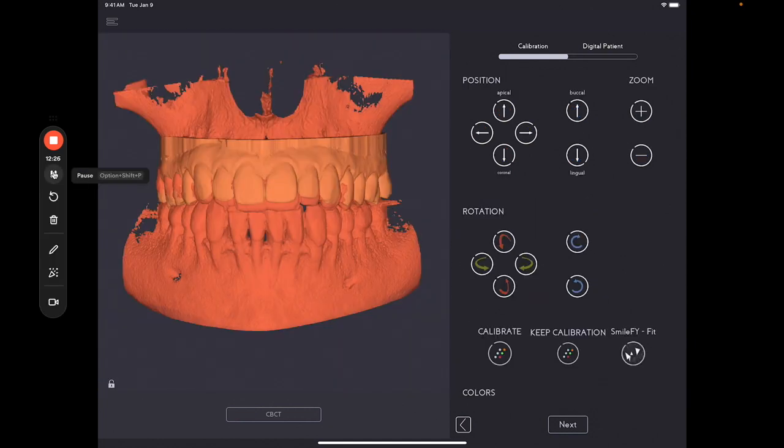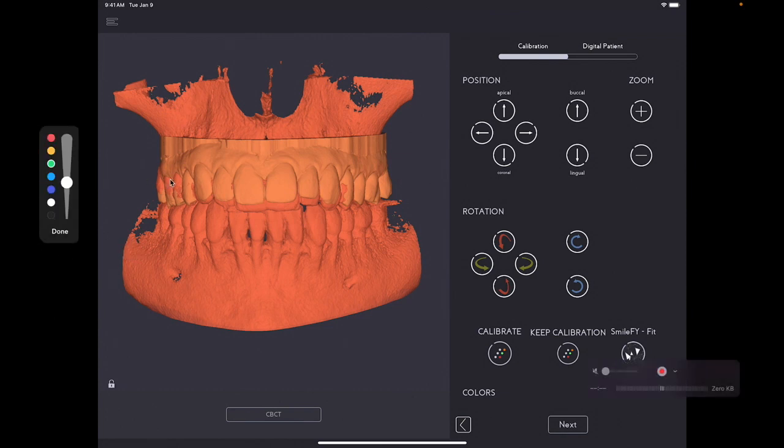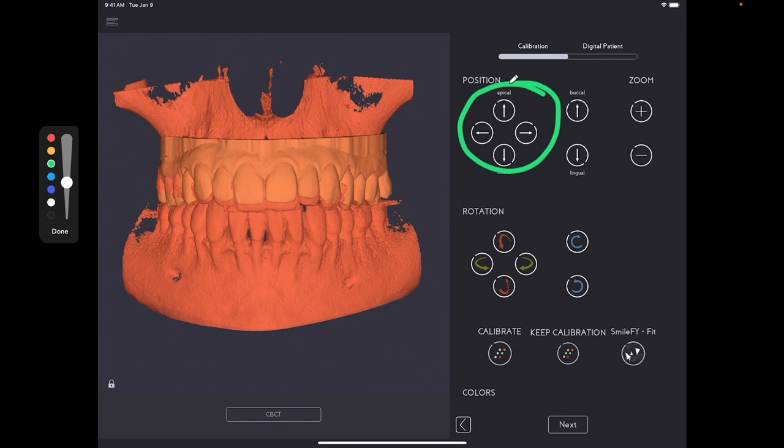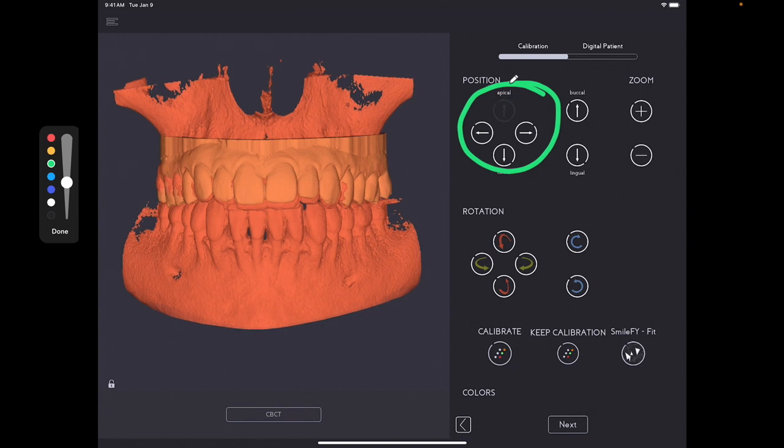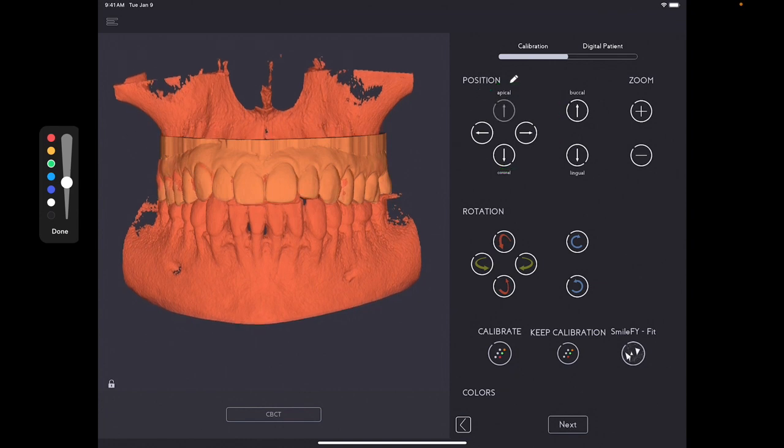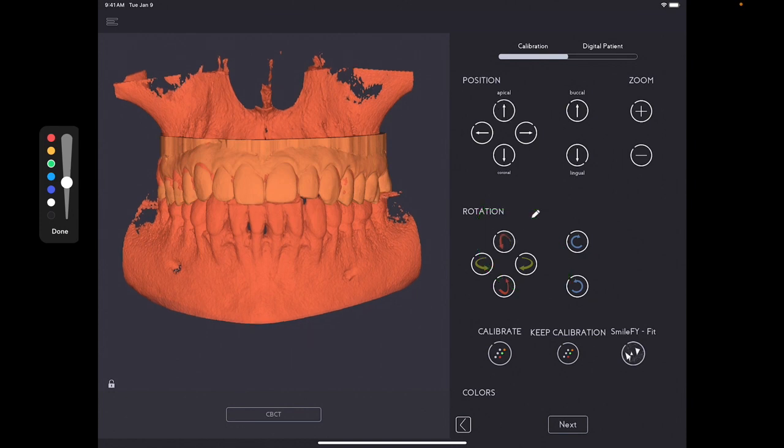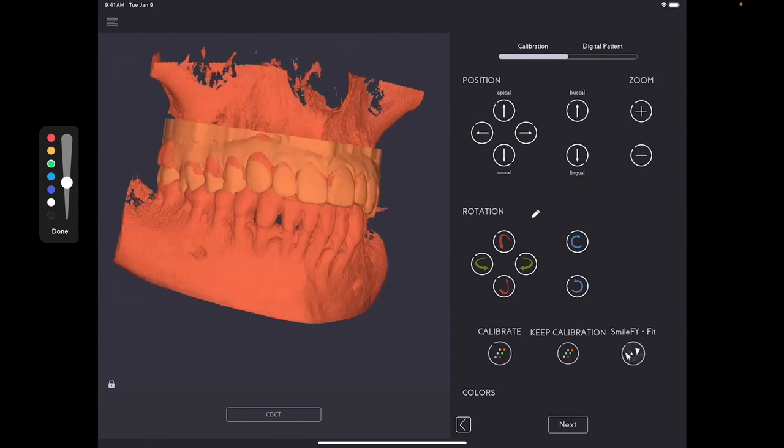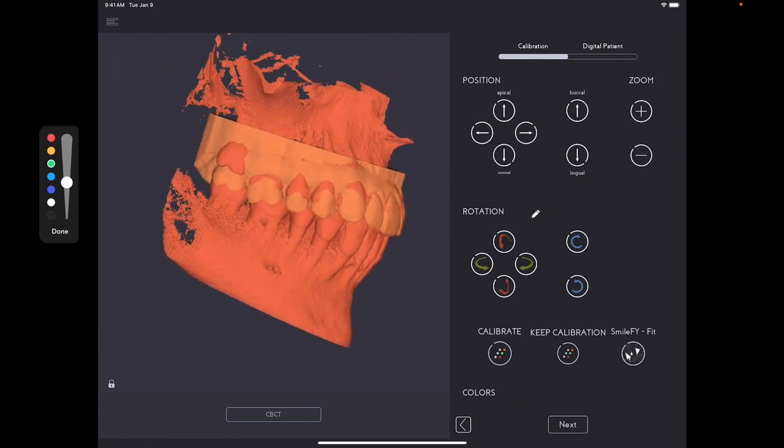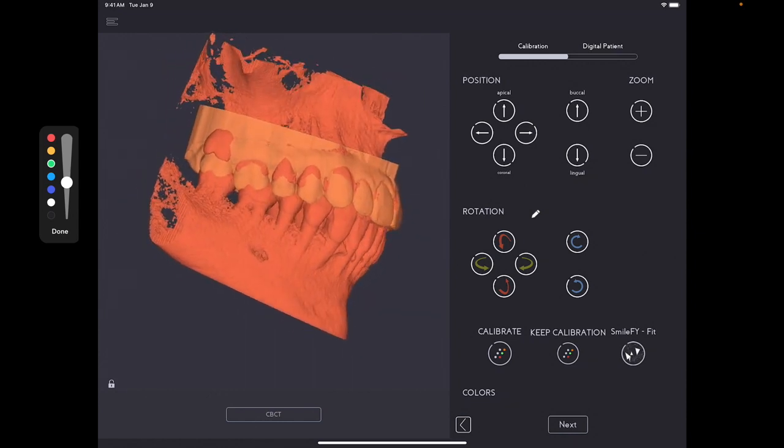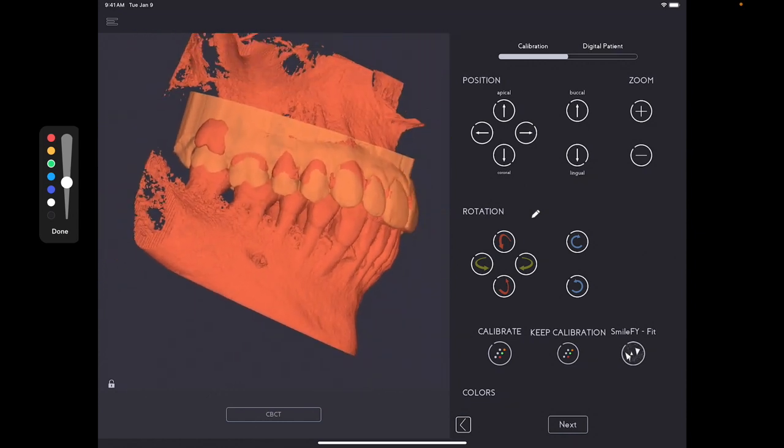And then here you can use these commands on the right side. Let me get a pencil. And then here, for example, we can bring it more apical. We can rotate if we have to. Bring it more buccal. The goal here is to make sure that it's as close as possible to one another.